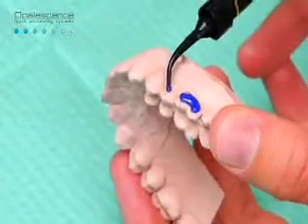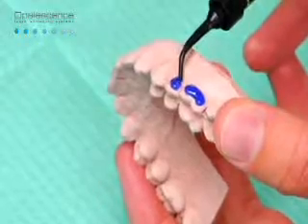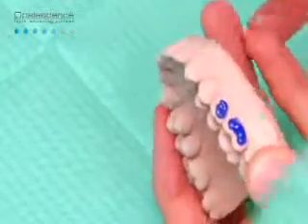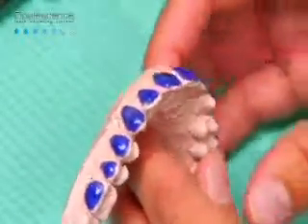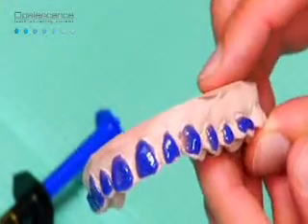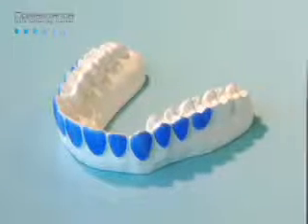To create reservoir space on the model, apply approximately a 0.5 millimeter thickness of Ultradent LC blockout resin onto the labial surfaces. Stay about 1.5 millimeters from the gingival line. Do not extend to the incisal edges and the occlusal surfaces. This prevents the margin of the tray from opening upon biting and/or impinging on soft tissues.